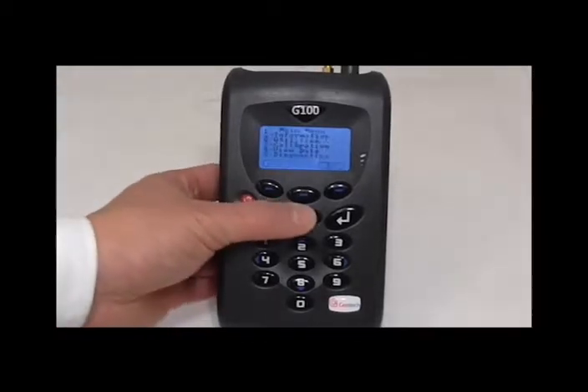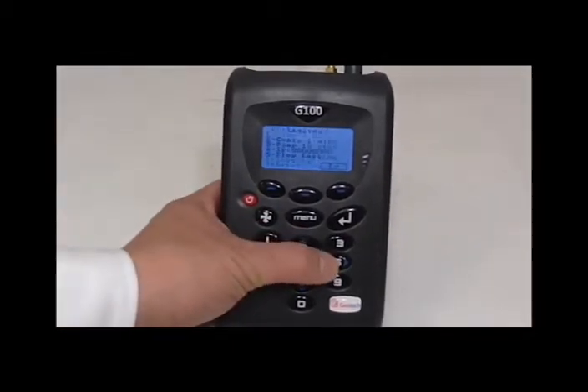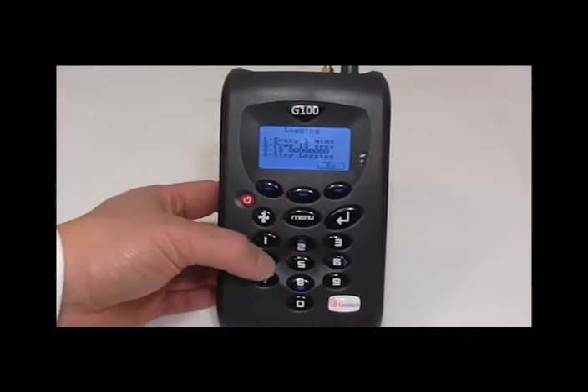If you wanted to stop the logging midway, press the menu button, then 2 for utilities, 6 for logging, and press 4 for stop logging.